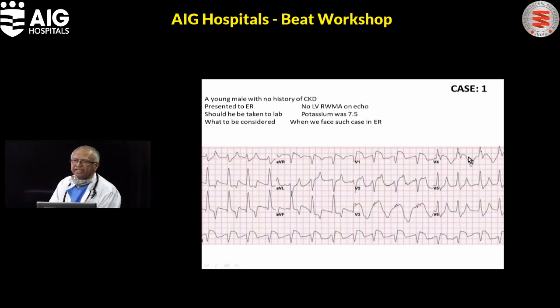It's not a mild hyperkalemia as far as the cell is concerned. It's very severe hyperkalemia. Along with that, you can see a marked peaking of the T wave and effacement of the ST segment. What is confusing the picture is the ST elevation in V1, V2 and an ST depression in inferior leads. So in fact, several years ago, Dr. Levine described this as a pseudo-infarct pattern.